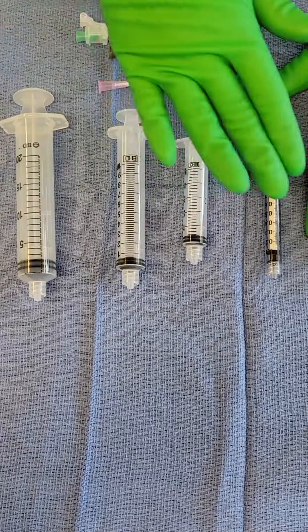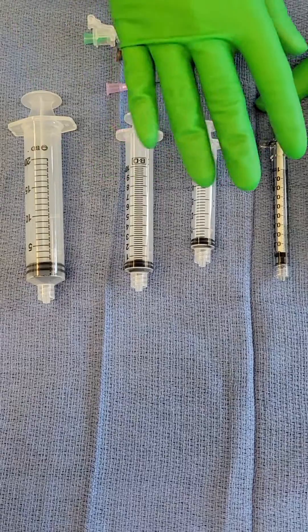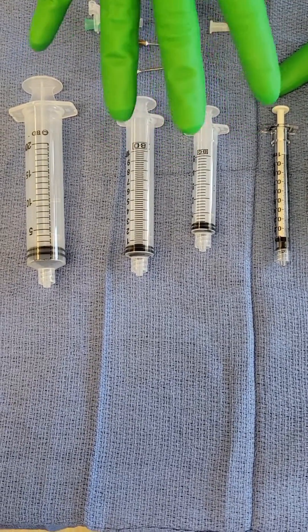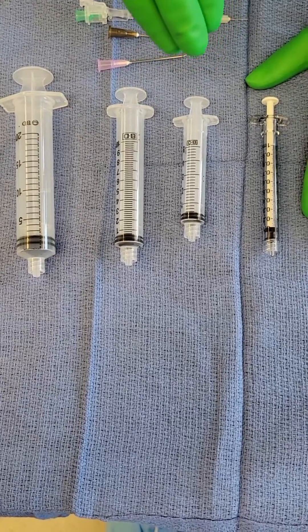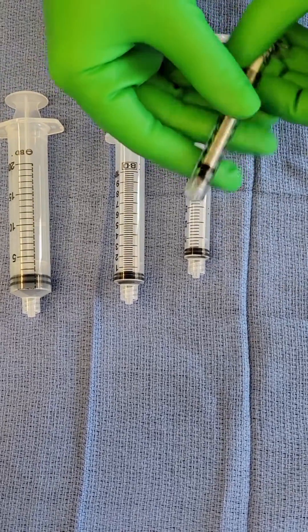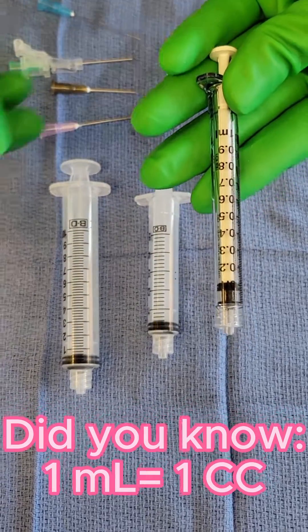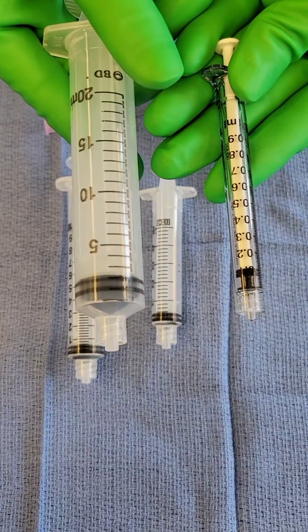The next thing we wanted to talk about was syringes. You want your syringe size to as closely as possible match up to the amount of medication you're injecting. So if you're injecting 1 ml of a medication, you would not want to draw it up with a 20 ml syringe.